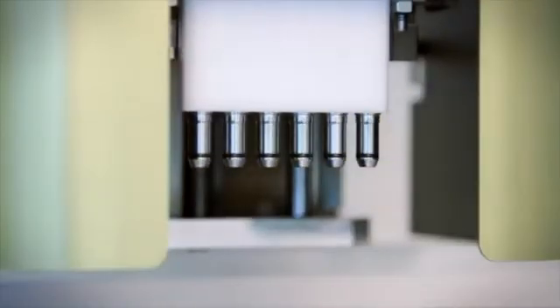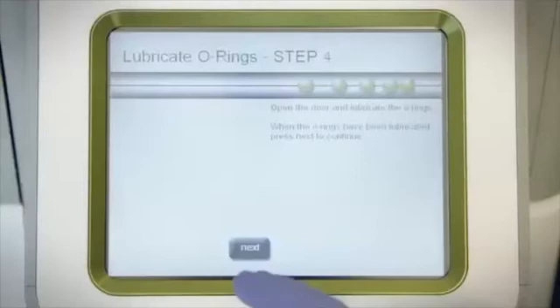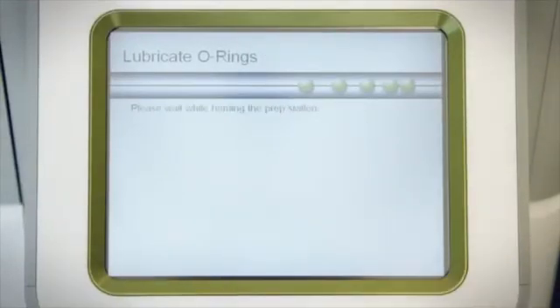It is important not to use too much grease on the O-rings because this can cause sticking of the pipette tips and subsequent problems during later prep station runs. If there's excess grease on there, continue to use a clean gloved hand to wipe away the excess. Once the O-rings have been lubricated, hit the next button and return the machine to its home position.